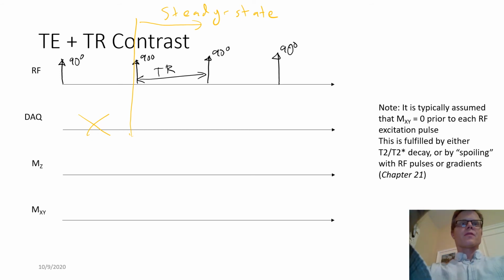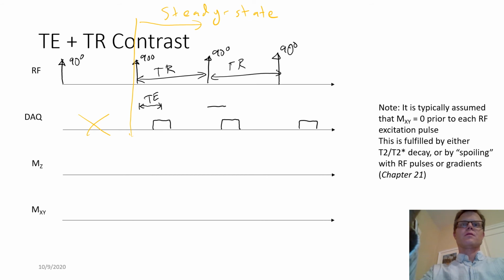And this time we're going to add a little bit of a delay between our RF pulse and our data acquisition. This will be our echo time. Both the TR and the TE are kept the same during the scan.